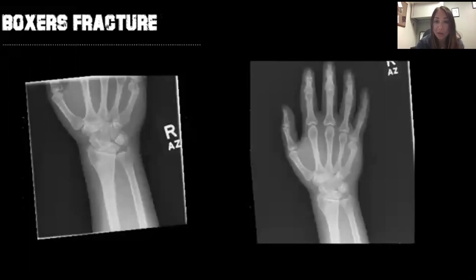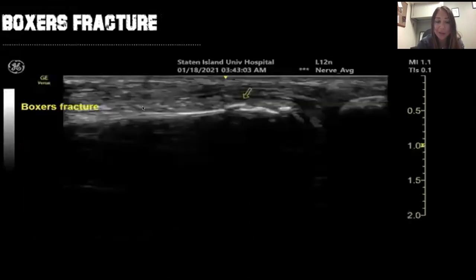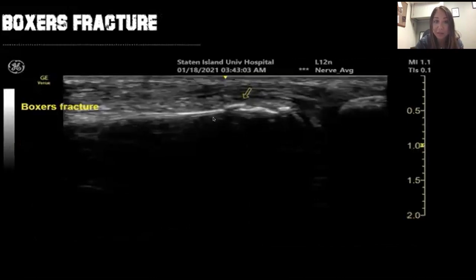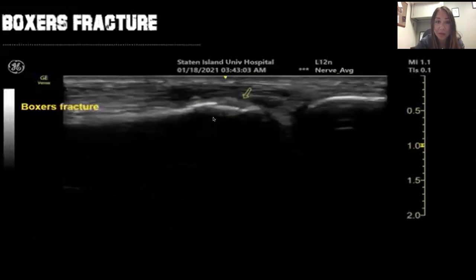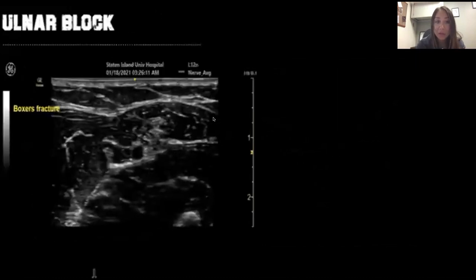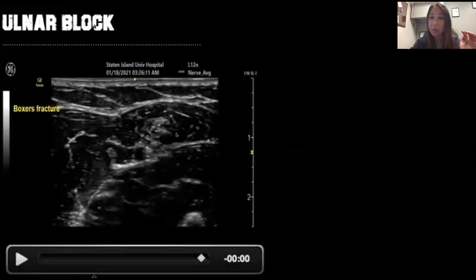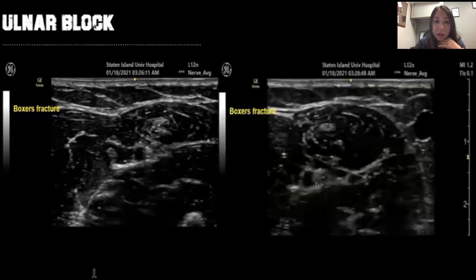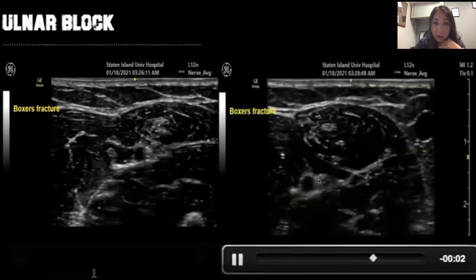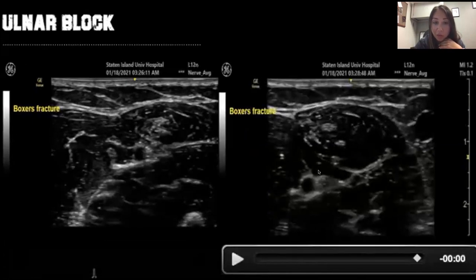Boxer's fractures are fifth finger fractures — you can somewhat see them on x-ray, but ultrasound is much better. You place the finger in a water bath, find the normal bone, and where the arrow points you see the discontinuity — that's the fracture. For boxer's fractures, especially if painful or dislocated, we want to reduce them. We find the ulnar nerve — that honeycomb structure — right next to the artery, and anesthetize the area to help with the reduction.